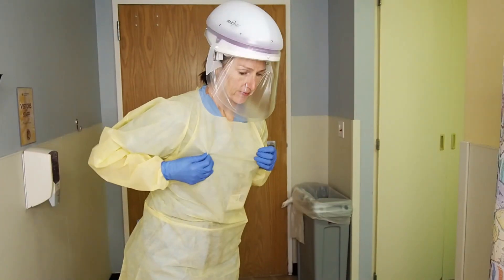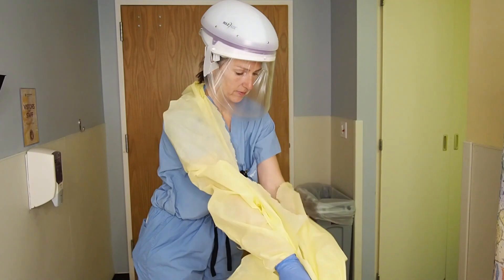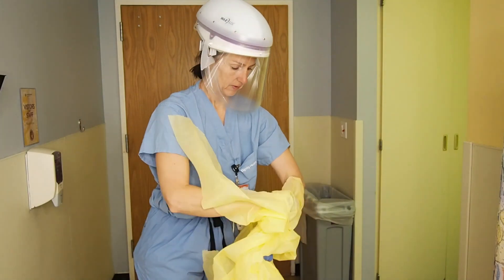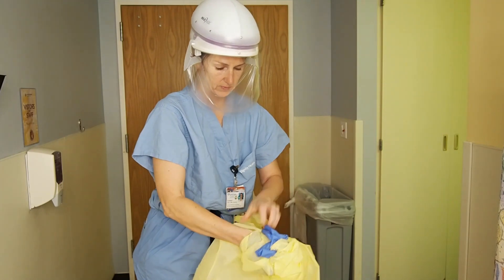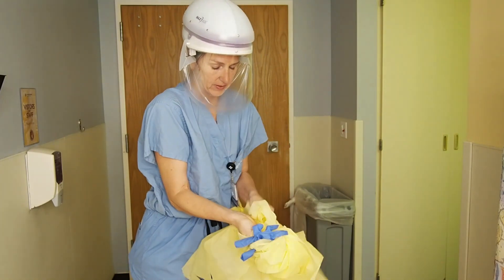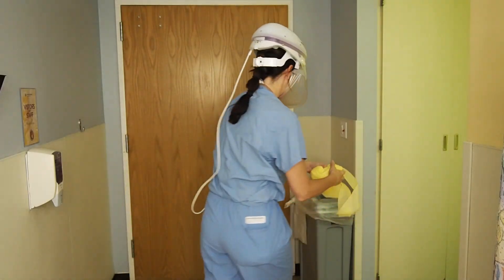Doffing personal equipment after patient exposure is when you are most at risk — be careful. In the ante room, first lean forward and pull your gown away at the waist and shoulders, breaking the straps. Pull your arms out from the inside, being sure to take off your gloves without touching the outside of the gown. Bundle or roll it up and place it in the trash.